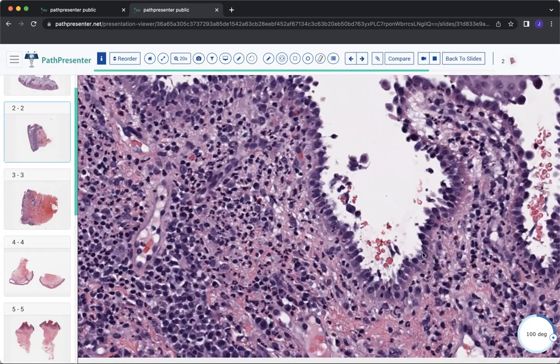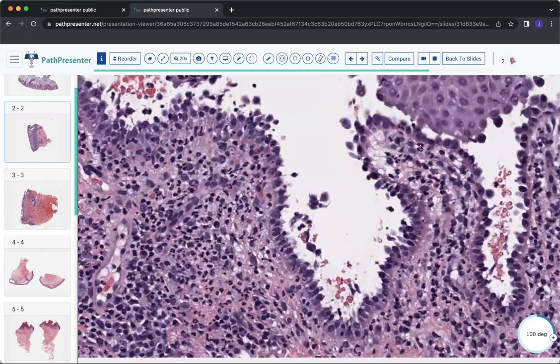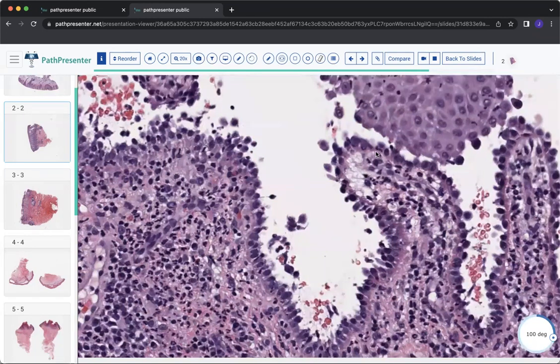working here. They've got bullous pemphigoid antigen still working here. They got a lot of things still here. And so that's why these basal layer keratinocytes are still adhering very well, because they have all those other proteins that are going to allow them to anchor down to the dermis, but they don't have the critical protein desmoglein 3 to help keep them stuck together right here.